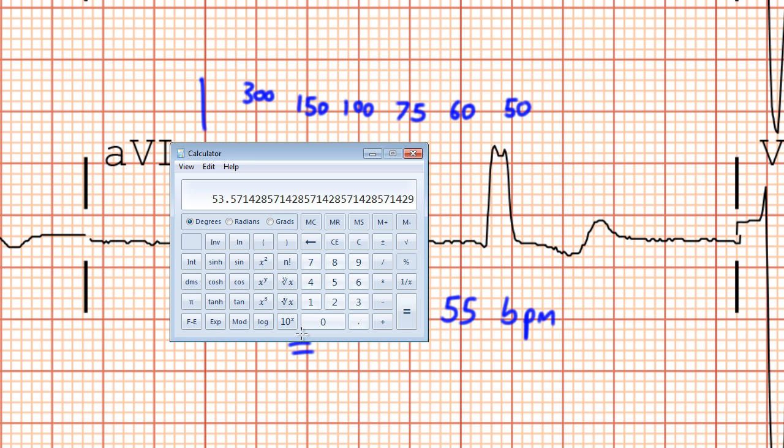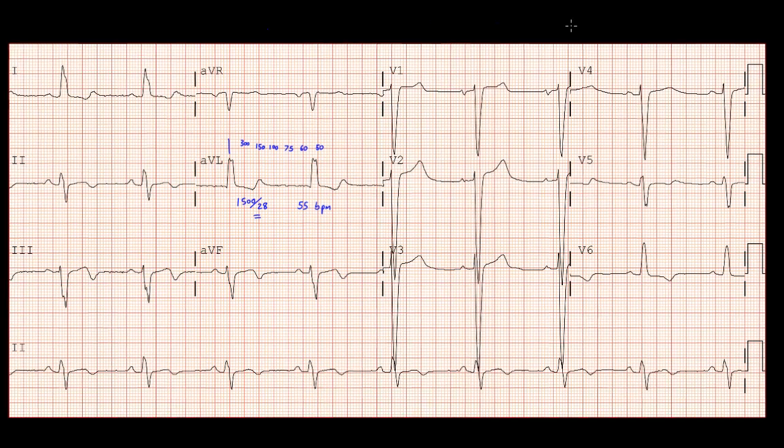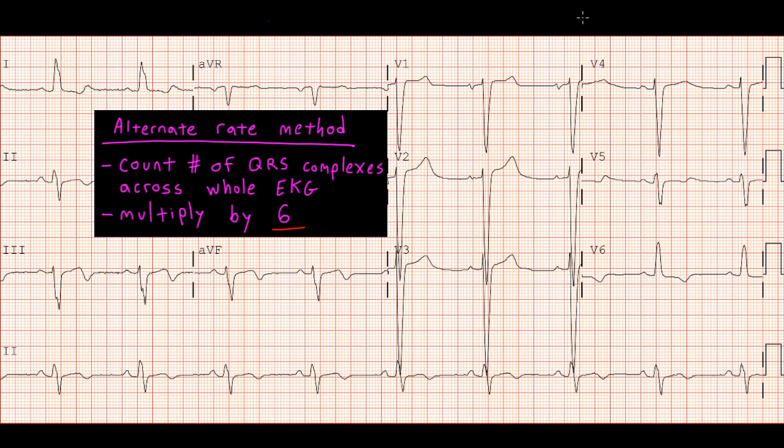So besides the box method, or the 300 divided by X, or if you're totally OCD, the 1500 divided by X method, there's another way you can figure out the heart rate pretty easy. And that just requires you to look at your 12 lead EKG as a whole and consider the fact that the entire 12 lead tracing lasts for 10 seconds in duration. So all you have to do here is count the number of QRS complexes on your tracing and multiply it by 6.